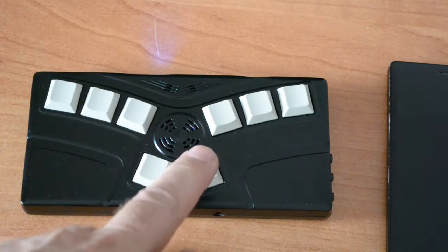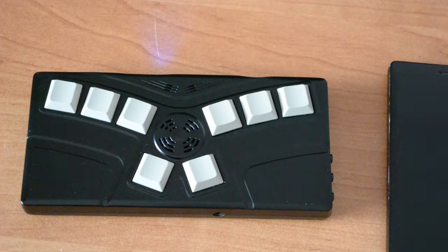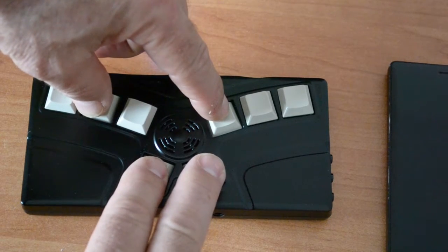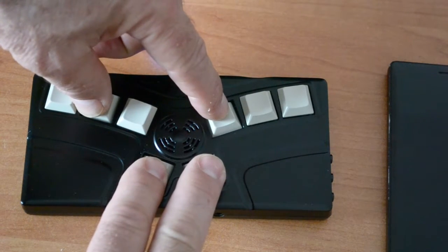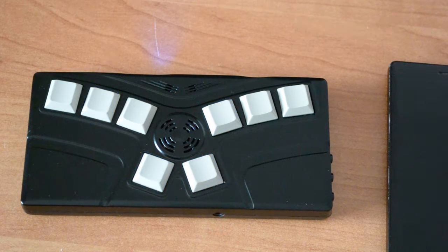On the list we have only one device, my computer. You can go through the list by pressing the left or right key, so dot 7 and dot 8. To add a new device we have to press the insert key, so the letter I with the dot 7 8, so dots 2, 4 and 7 8. Do you want to add new device to the list?